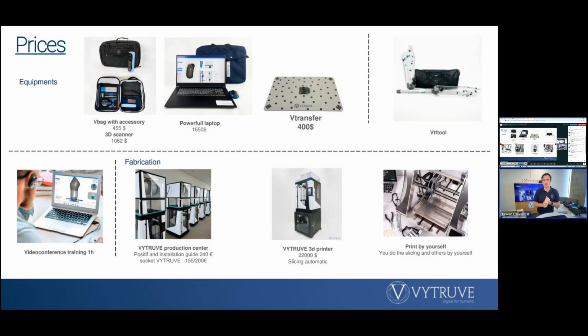Everything is closed to avoid humidity and temperature changes. You can print 60 centimeters of socket, so it's a big socket. It's also possible to print a big positive.